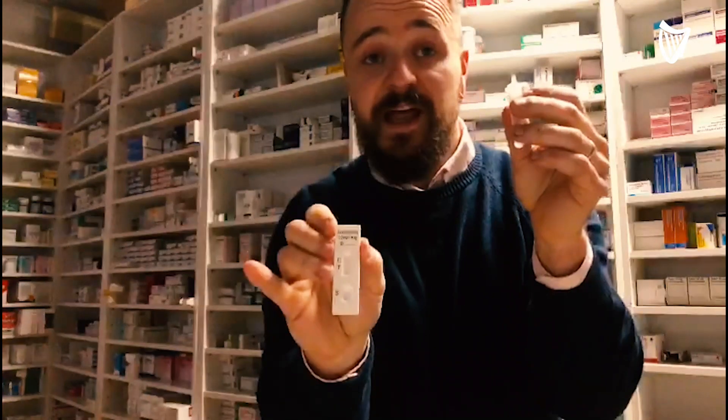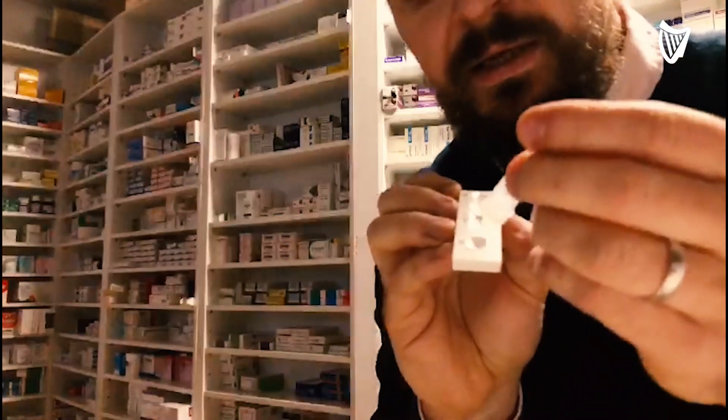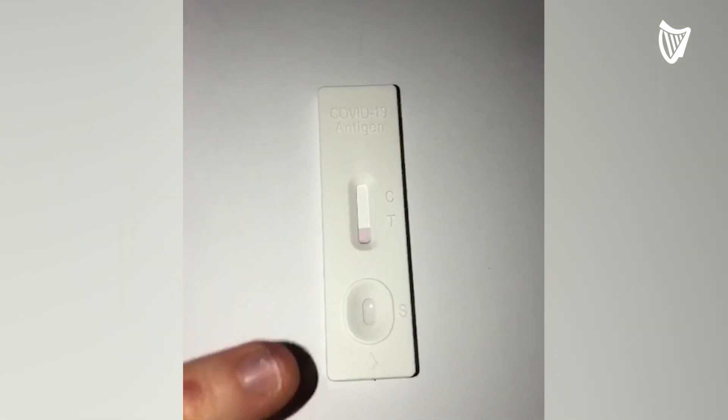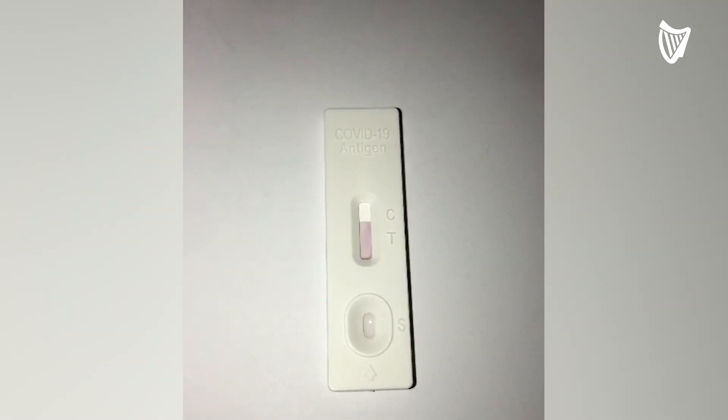On a flat, clean surface — as we discussed at the start of the video — we add our reagent along with our sample to the plate, and we can instantly see that it's been drawn up through the plate. What we need to do now is wait 15 to 30 minutes, depending on the test, to get our results.